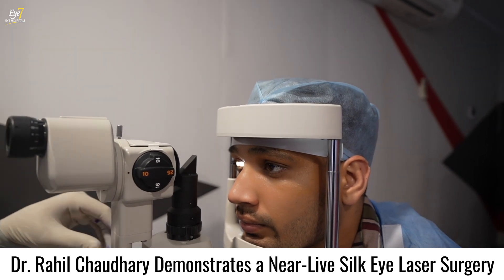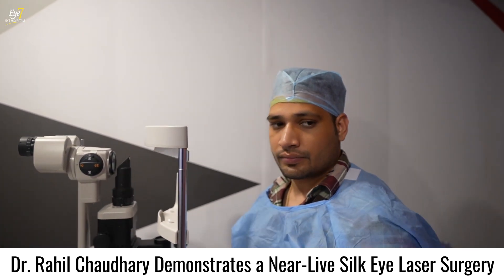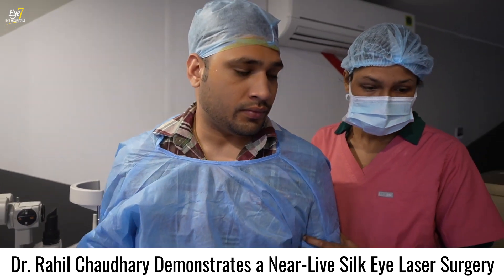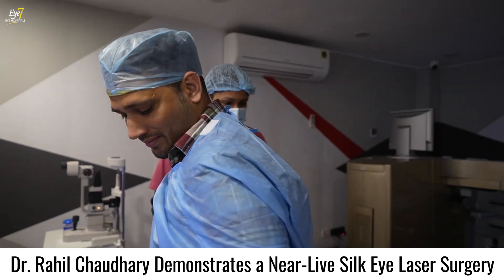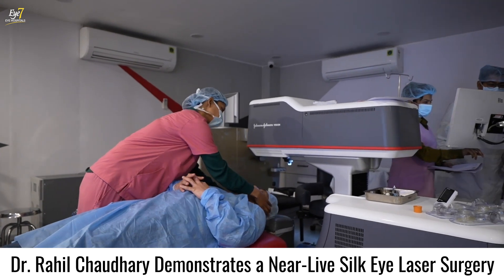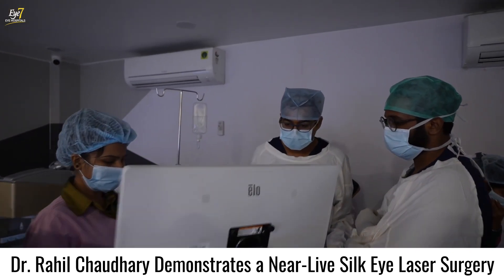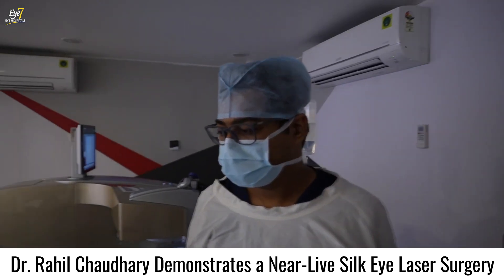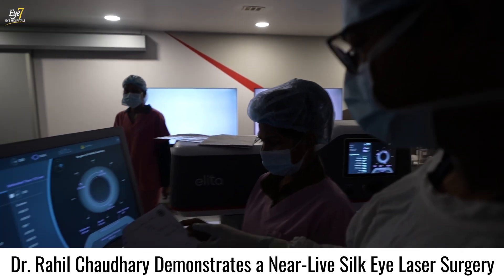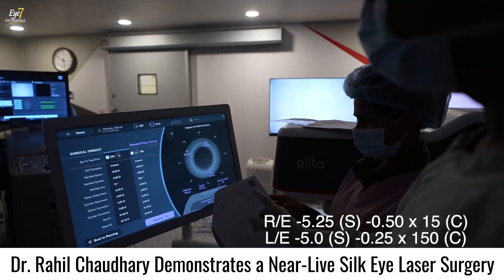After completing the marking, we shift the patient to the Elita SILK machine. This is how the machine looks — it has a small footprint and doesn't occupy too much space. I am showing you the parameters here. We are correcting about five diopters of sphere with about half a cylinder.